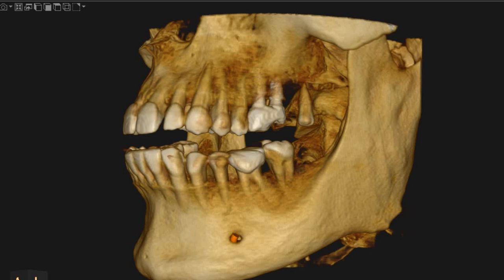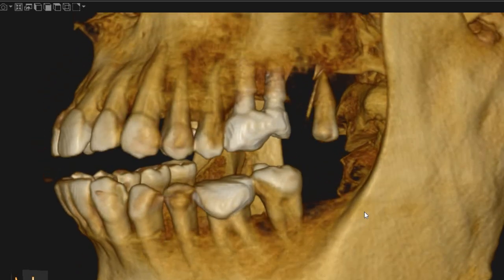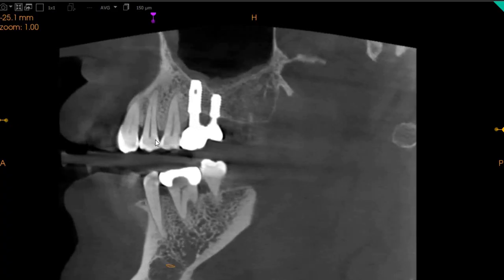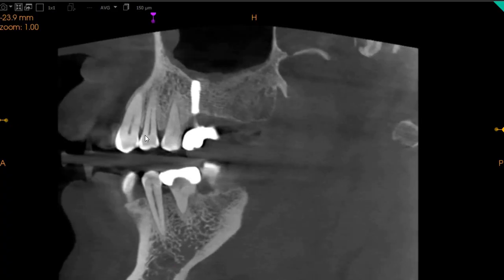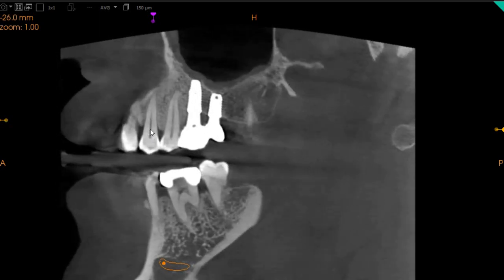Assalamu Alaikum, Ultra Scan Diagnostics here. This is the CBCT of the patient which you have requested. The area of interest is the upper left four and five for possible fractures. This is the sagittal view, which is basically the side-to-side view. On the sagittal view, this is the upper left four.